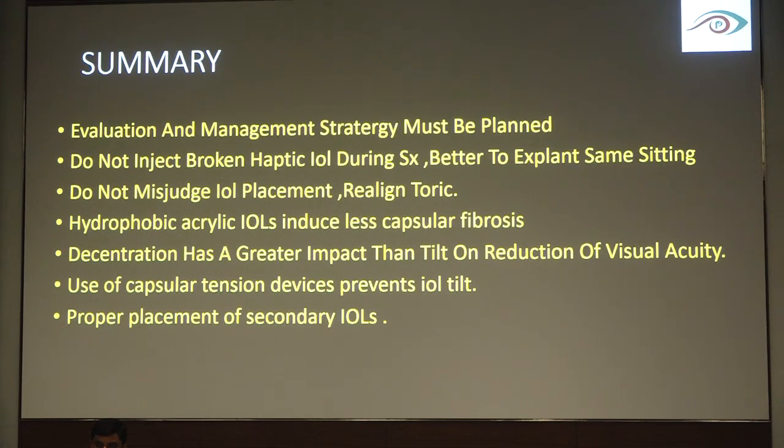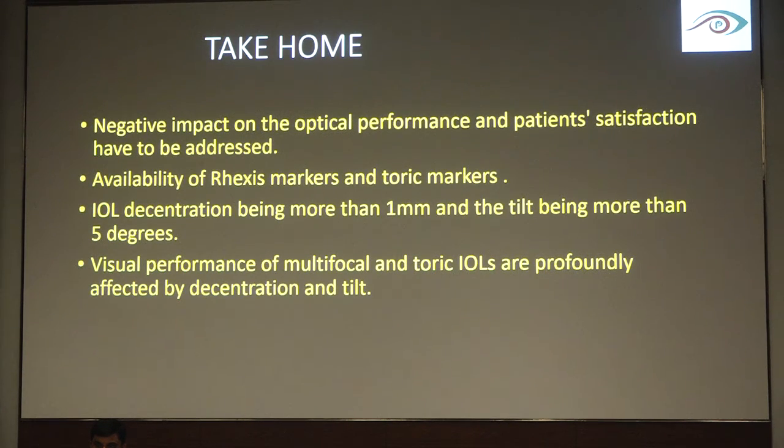Use your capsular support device wherever it is necessary. Hydrophobic IOLs are better because they're not going to cause you much capsular fibrosis. So the negative impact on the patient has to be addressed. Visual performance, especially in multifocal or toric, make sure your toricity is aligned, and that will again not give you IOL tilt and decentration.